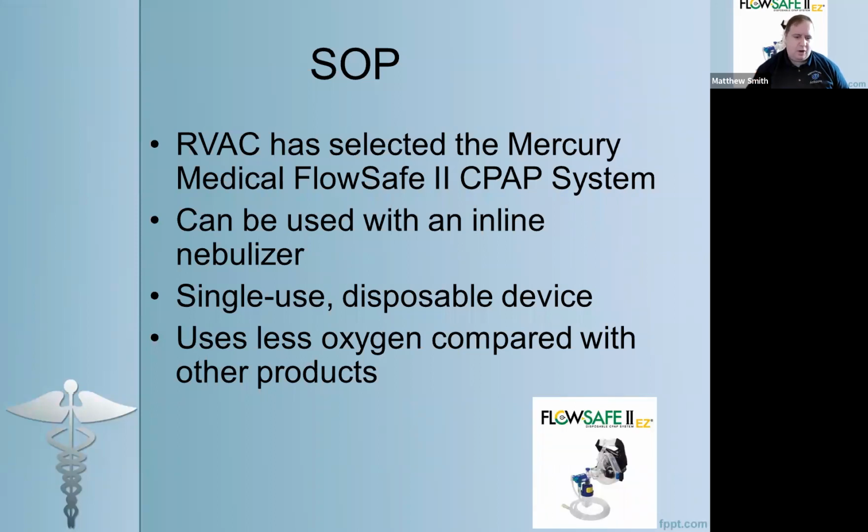You will not believe how quickly this will empty a tank. It is ridiculous. So you need to either get this patient out to the bus, get multiple tanks onto the scene, or even request backup if it's going to be an extended extrication, because this will blow through your tanks like you wouldn't believe.